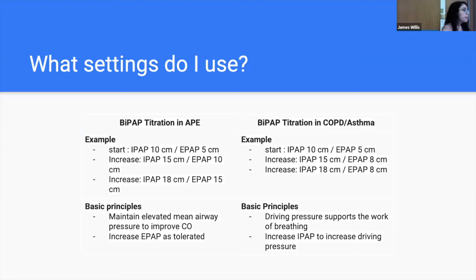And then the other thing is that you're getting recruitment of alveoli to help oxygenation. And the other thing that's important to note is that even though I'm talking about BiPAP today, CPAP also has very good results in the setting of pulmonary edema.